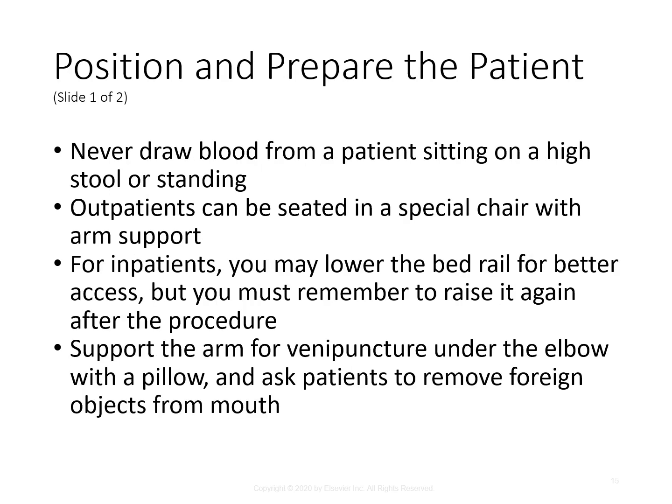And then you're going to position and prepare the patient. So you're never going to draw blood from a patient sitting on a high stool or standing, because there is always that chance that somebody could faint or fall over. Outpatients can be seated in a special chair with arm support.